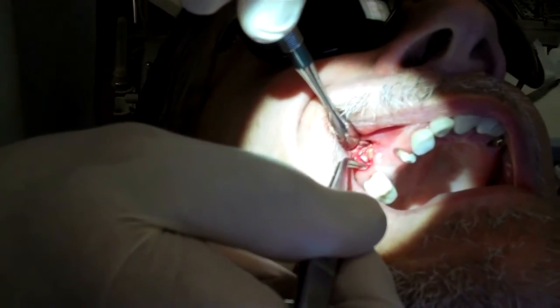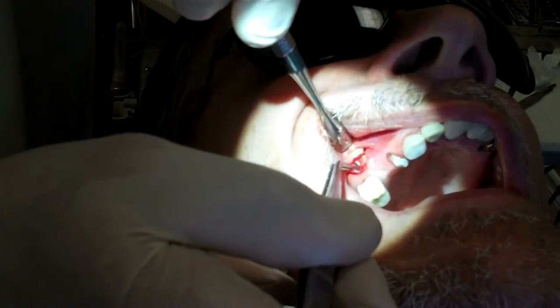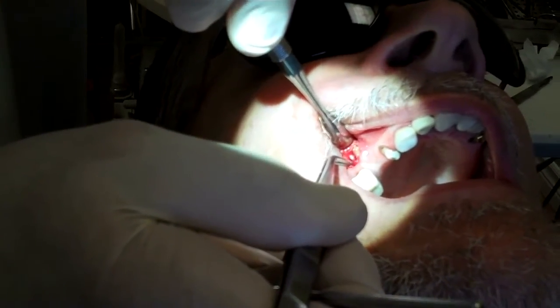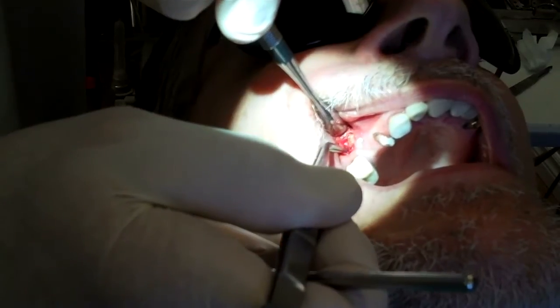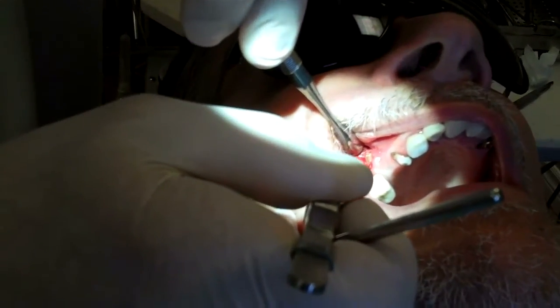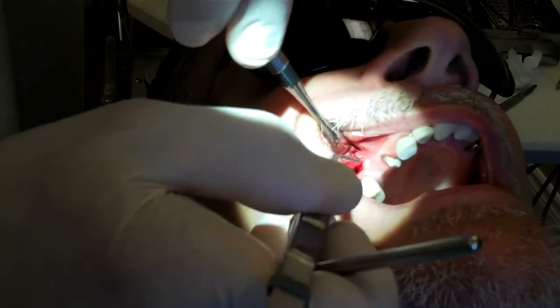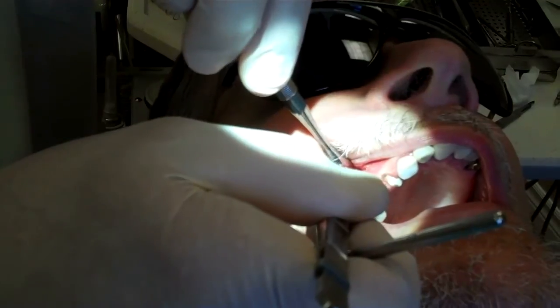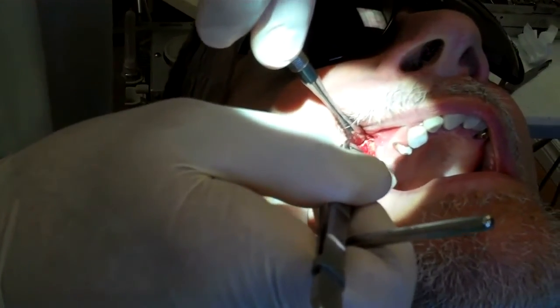He's been having problems with it for years. So what I'm doing here is placing a little baffle. It's going to prevent the grafting material that we're going to use from getting too far into where the sinuses are.